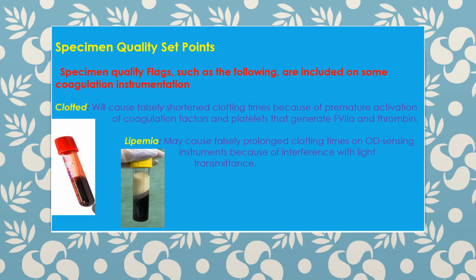Specimen quality set points. Specimen quality flags such as the following are included on some coagulation instrumentation: clotted, lipemia, hemolysis, and abnormal clot formation.